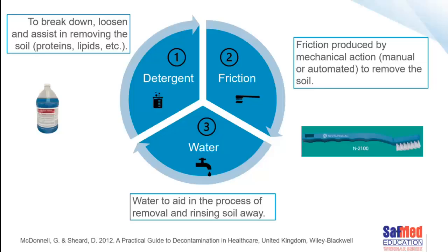Water, again, is a very important component. We need it to help with the removal and the rinsing away of the soils, as well as the detergent residues. All these together help us clean effectively.